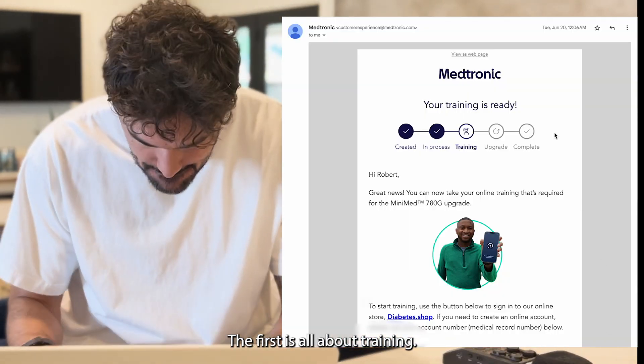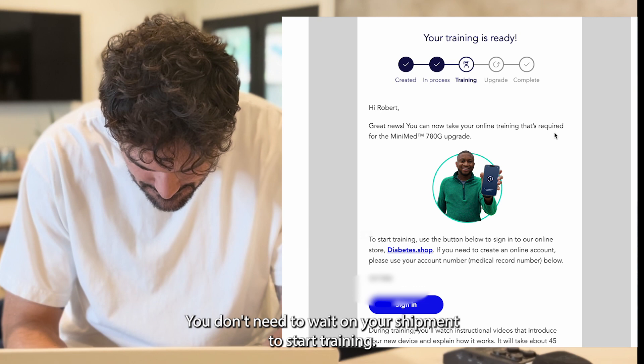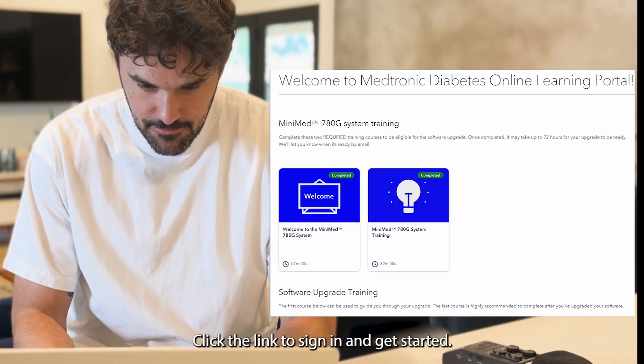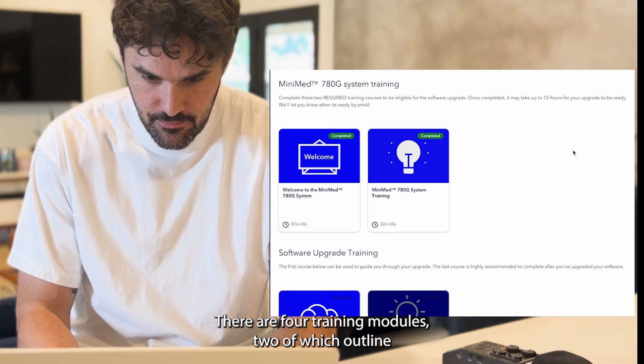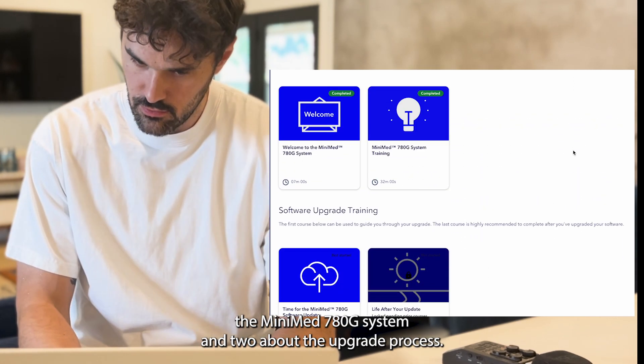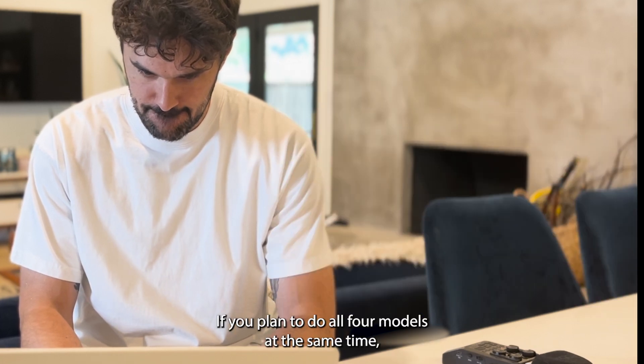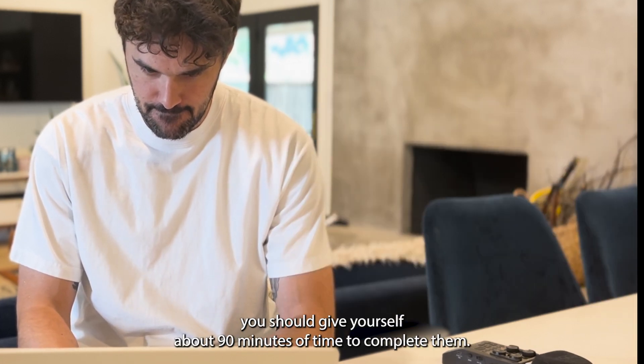The first email is all about training. You don't need to wait on your shipment to start training — click the link to sign in and get started. There are four training modules: two of which outline the MiniMed 780G system, and two about the upgrade process. If you plan to do all four modules at the same time, you should give yourself about 90 minutes to complete them.